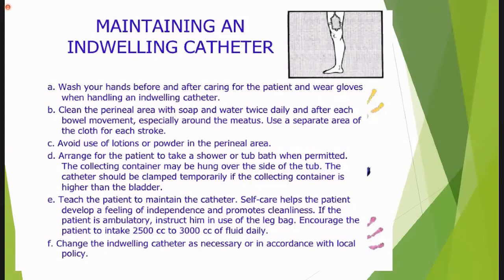And then attach the drainage bag with the catheter tube and secure the catheter to the thigh.